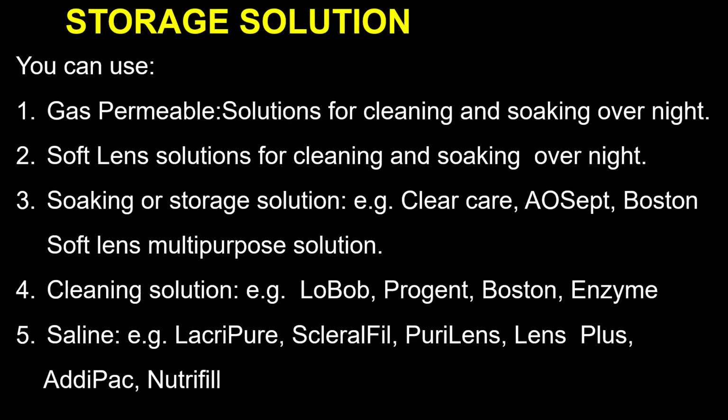The major thing is that you have to consider the size of the pterygium, because if the pterygium is too big, that can distort the fitting of the scleral contact lenses on the sclera. Remember, the pterygium usually is on the conjunctiva, right?